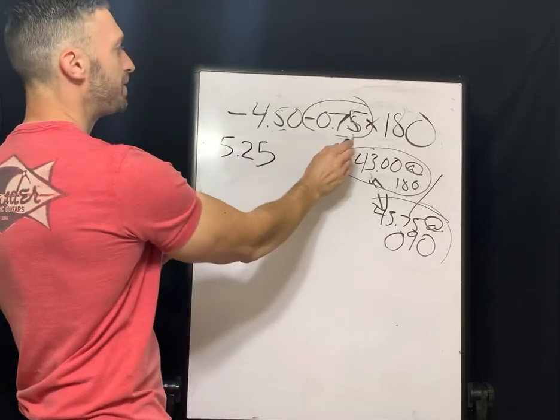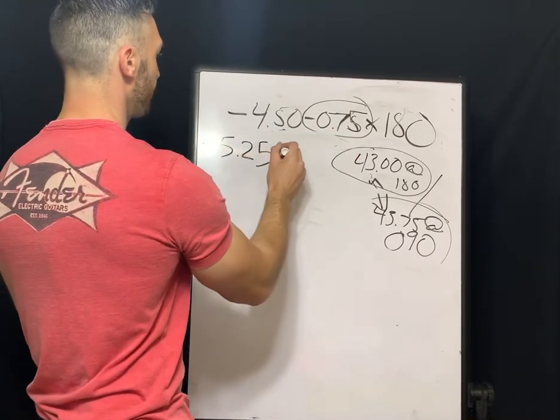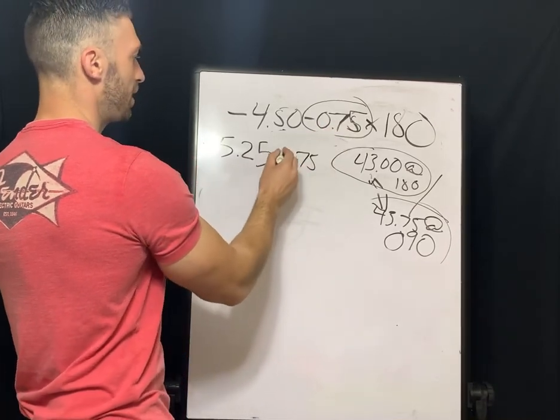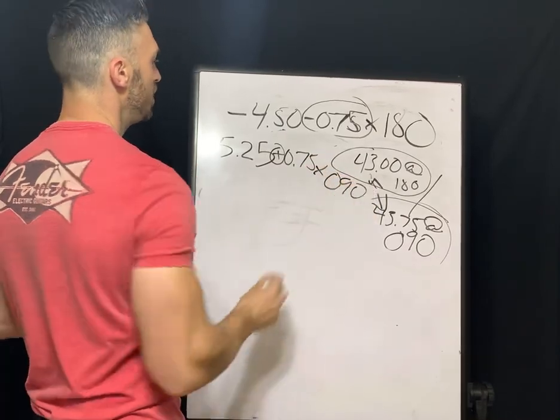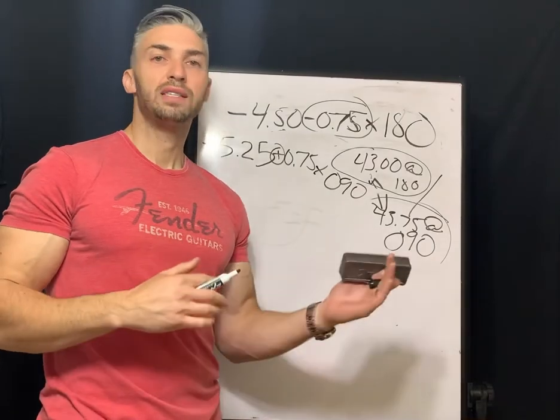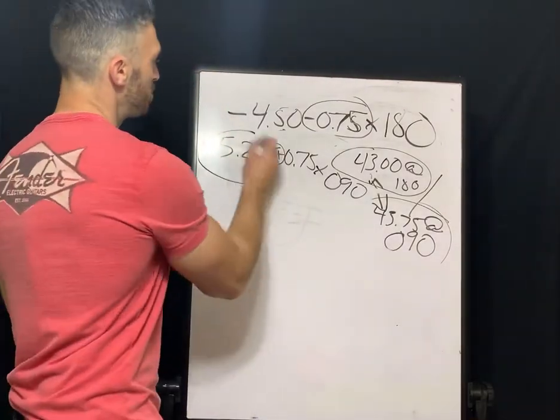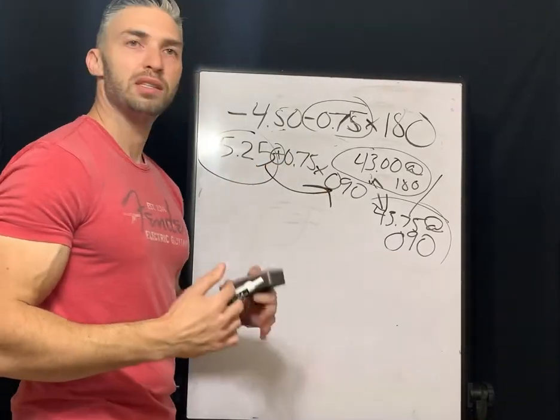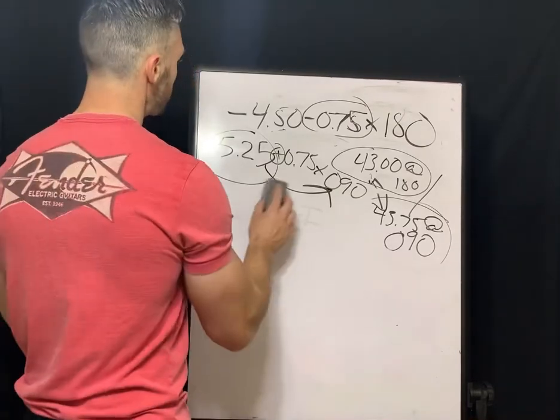so you add the -0.75 and the -4.50, you get -5.25. You drop the cylinder value down, change the sign, and rotate the axis 90 degrees. So when you transpose, all you're doing is showing the flattest and the steepest power of the lens. Again, we see the most power along the 90. It's just proving that it's the with the rule astigmatism type. Just another way you can check yourself.